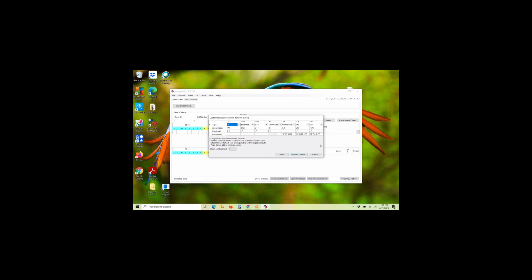And you can decide if you want check cells or not. For most of, actually, I think all of the automated systems out there right now, there aren't check cells, so you'll see them come across without check cells. When we do manual tube method, we're going to mark the check cells off for those areas that need it. I don't think I set up a gel column here, but if we wanted to, we could set it up on the fly. I think we're going to actually do that in one of the demos, so you'll see how we do that.